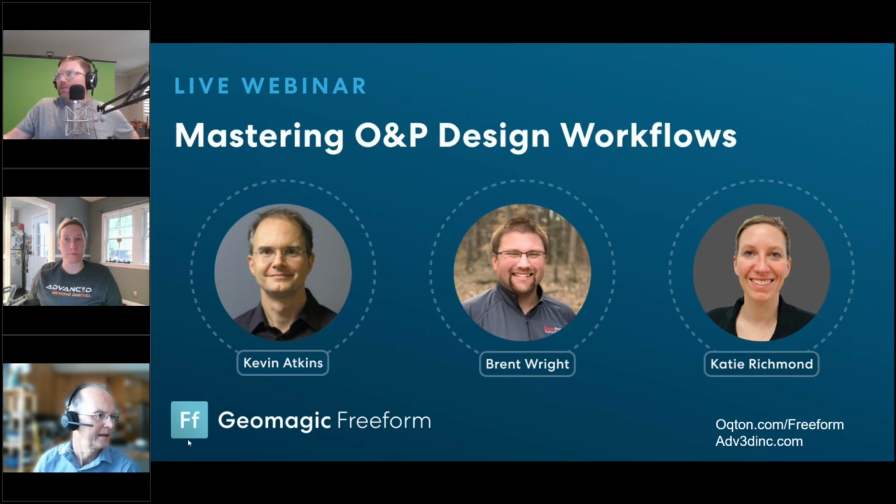Yep. There's a question here on, is it possible to get a Dynabot file as an example? When you load the software, if you go to the load point, there's actually a whole ton of Dynabots in there as example Dynabots. So you can go through those and start to see how they're written and learn how they're written. And then also there is a reference guide in the load point for the software as well. It's not a full user guide, but more of a reference guide on how to write Dynabots and all the different functions of Dynabots. So that's already in there.